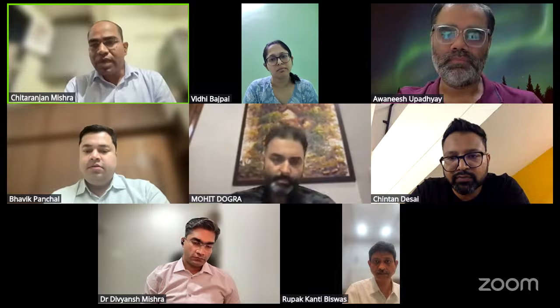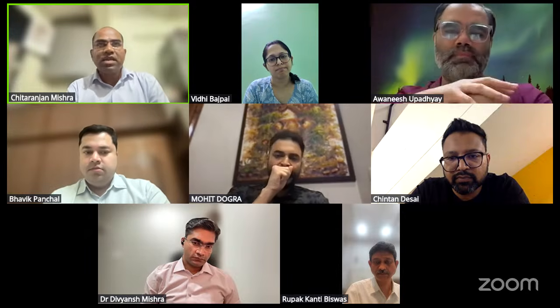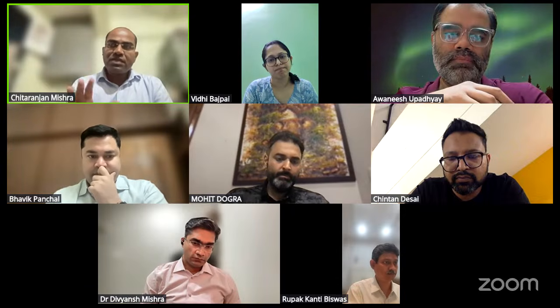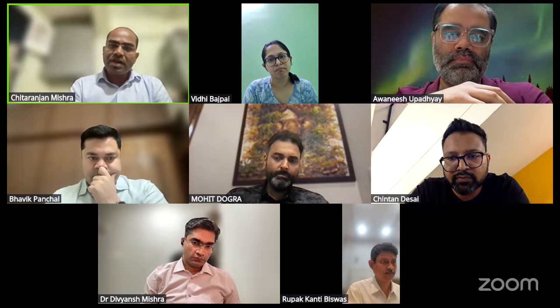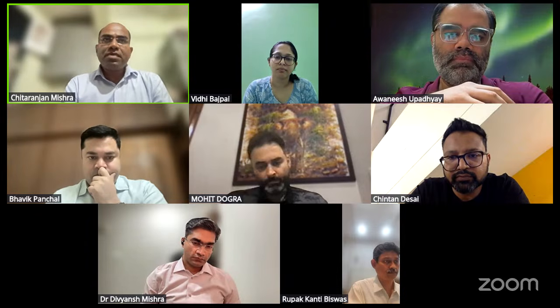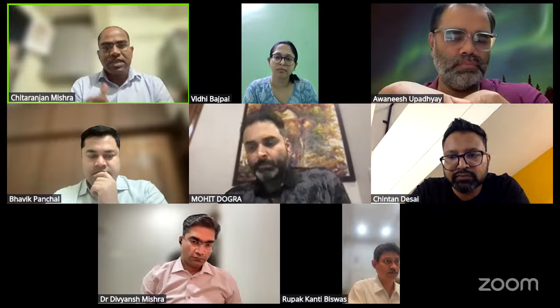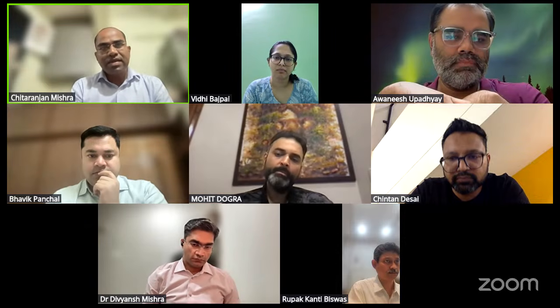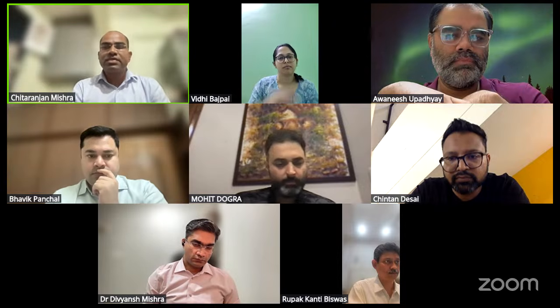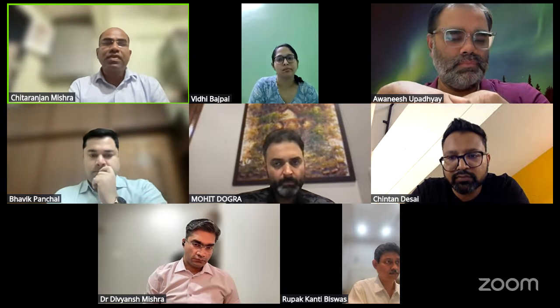Just one change to what Dr. Chintan has told. Before putting PFCL, he has already stained the ILM and done the ILM peeling. But we have been doing PFCL first, then staining and peeling the ILM under PFCL. That will be against what Mohit and Divans told, that we are stuffing it inside.